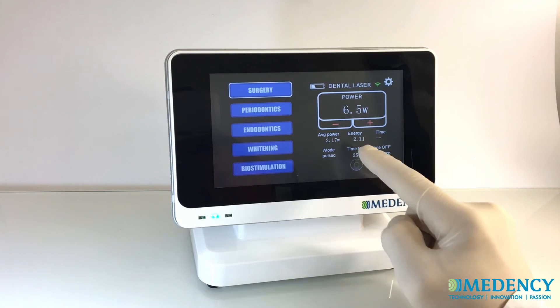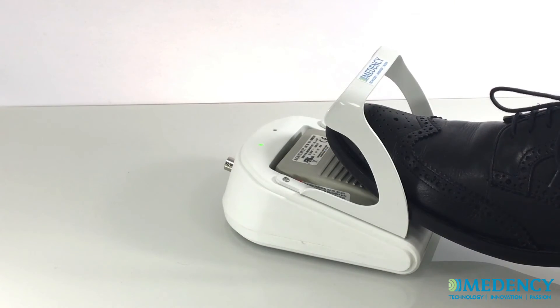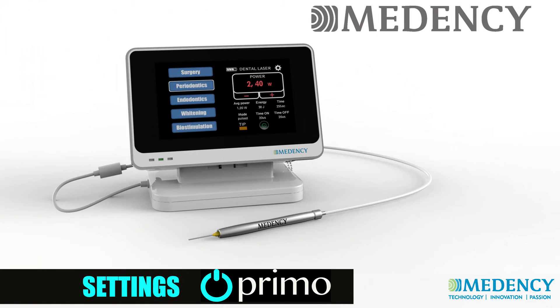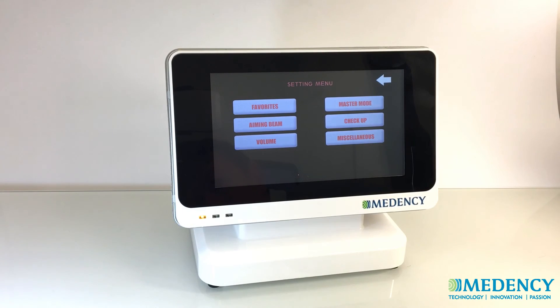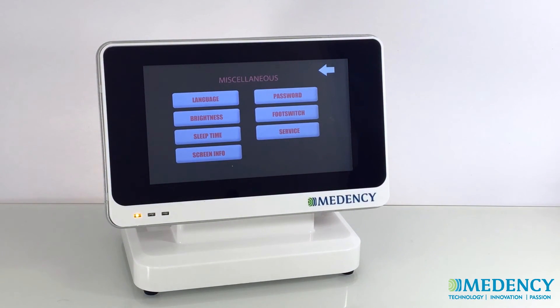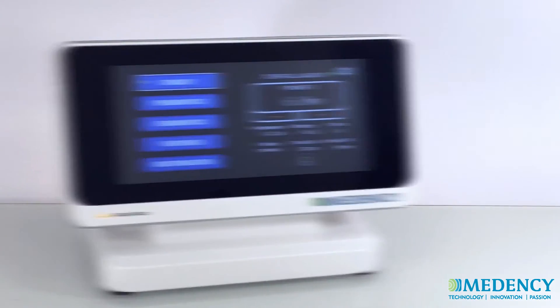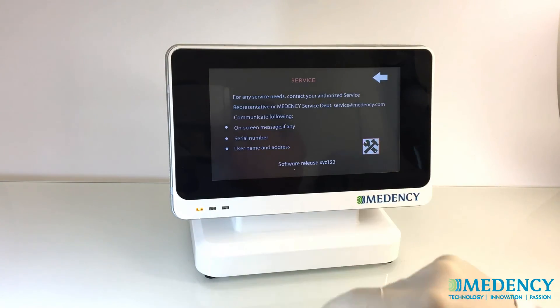Now press the control button and the unit will move from standby into ready mode. Press the foot switch to start operating. To adjust system settings, tap the setting icon on the main screen. On the settings screen, it is possible to change the aiming beam, volume, language, brightness, and a few other items. The service mode button is accessible only by an authorized MedNC service representative.